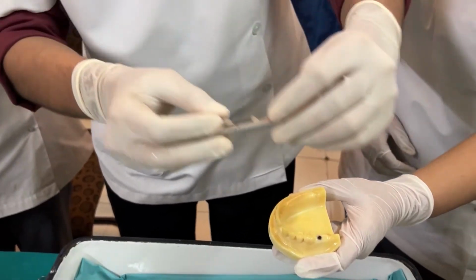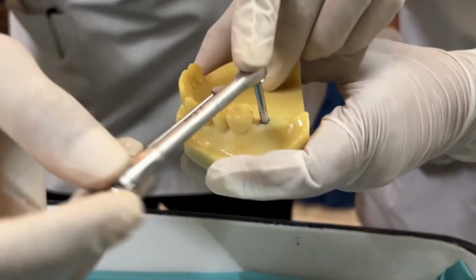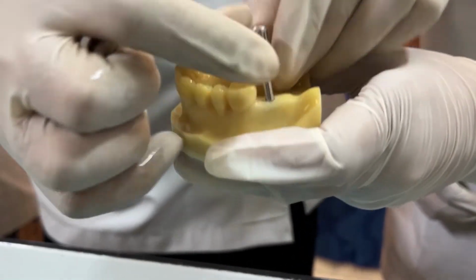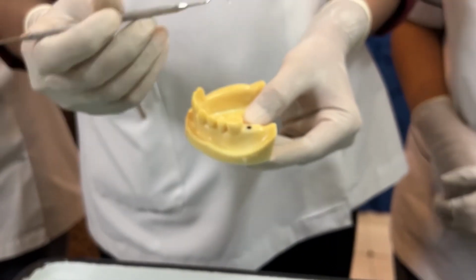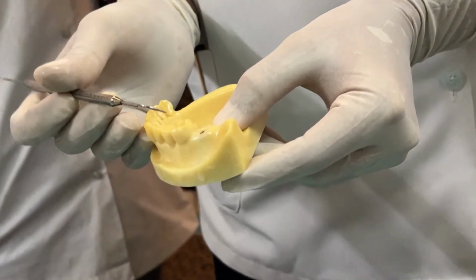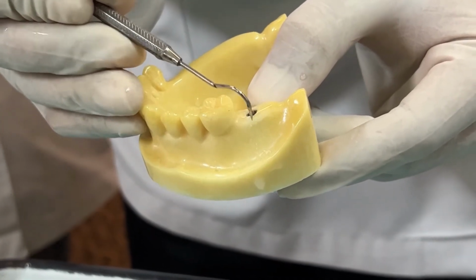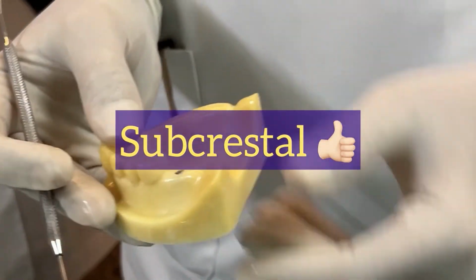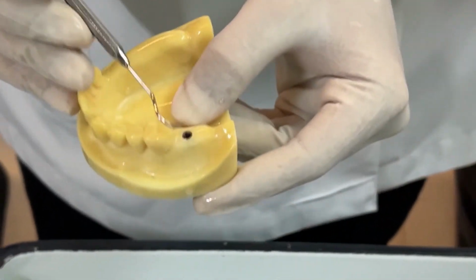So again I attach the extended mount, then I attach it in my implant, and now again what I do is I go a thread or so more inside. Slight subcrestal is what I am trying to do. So now this implant was already equi or subcrestal from the distal and the mesial side. Buccal side it was supracrestal. So again what I am supposed to do is check it again. So can you see? This time it is not getting stuck. So what does that mean? It is either equicrestal or it is subcrestal. So it is always better to check with this instrument.